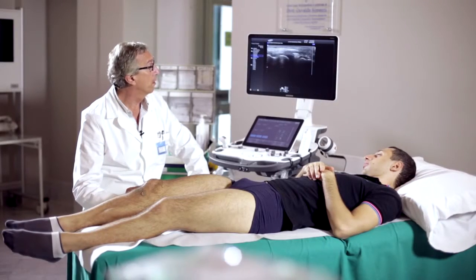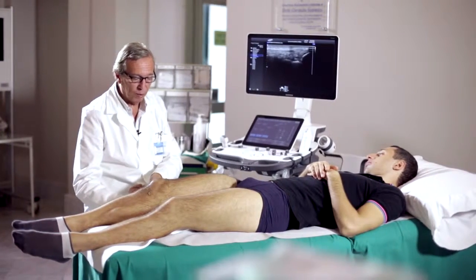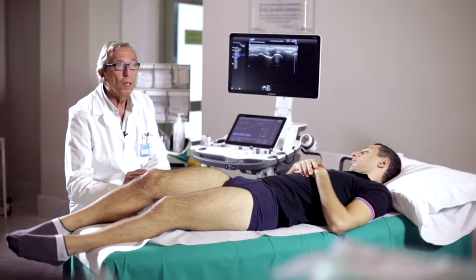Another very important structure is the distal tendon of the biceps femoris, which is localized contiguously and superficially with respect to the lateral collateral ligament. This tendon is examined up to its common insertion with the ligament at the level of the head of the fibula. The last thing to do is to evaluate the lateral collateral ligament, which is highlighted by flexing the knee a little more.